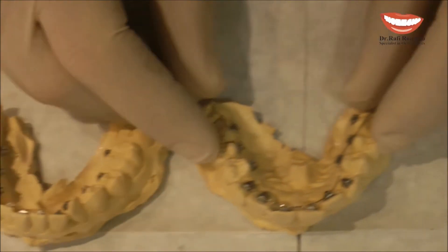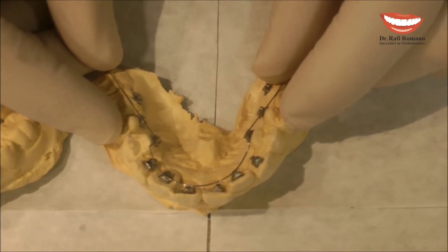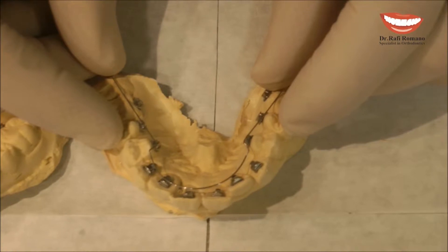The same can be done, of course, for the upper arch. You can see here, this is for minor proclination. I can, of course, bend a new wire for this upper arch.